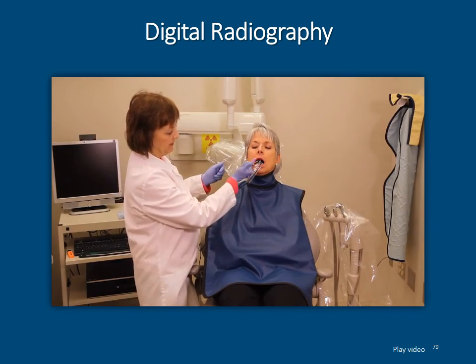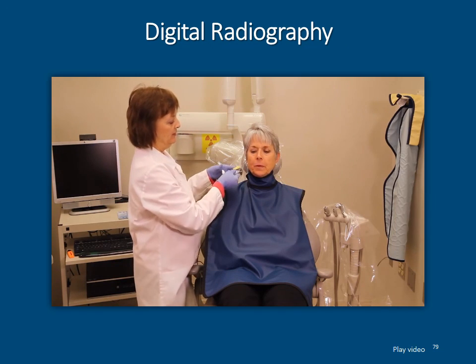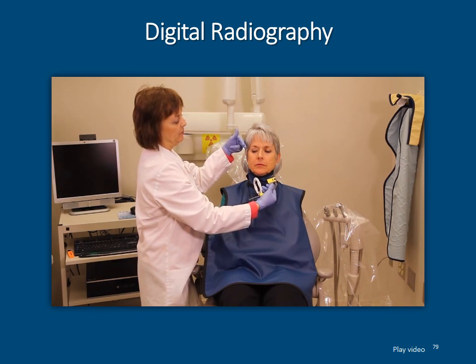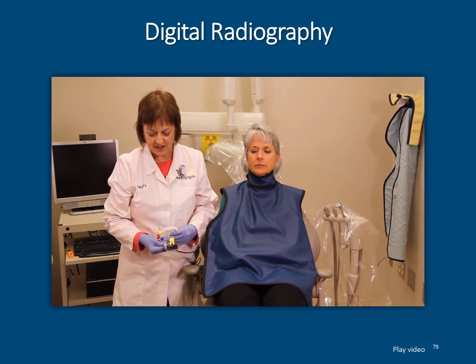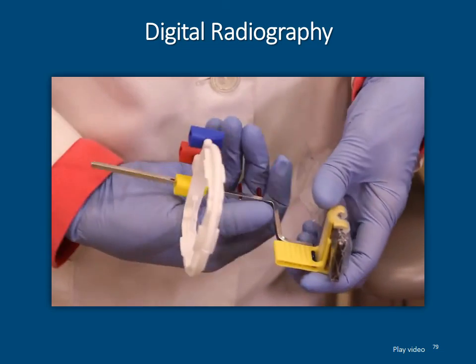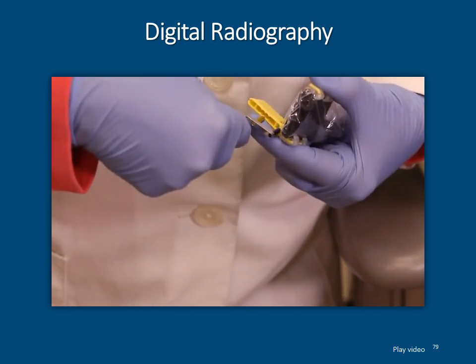Now you can bring your cone in, following the bar. Open. So you're going to do that molar, premolar, and then the molar and premolar on the lower left. Those two quadrants are done. Now you have the final two on the upper right and two on the lower left. To do that, though, you have to change the position the way that this is put together. I suggest first pull this bar off and put it actually onto the other side of the bite block.